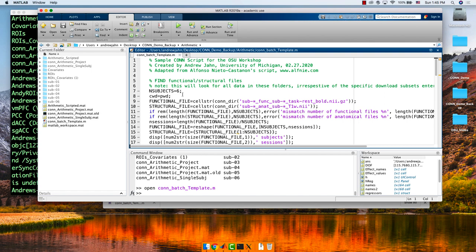Mine assumes you've already downloaded your individual files and are ready to analyze them. So if we wanted to do a group analysis on these six subjects, let me just walk through some of the highlights of this script.